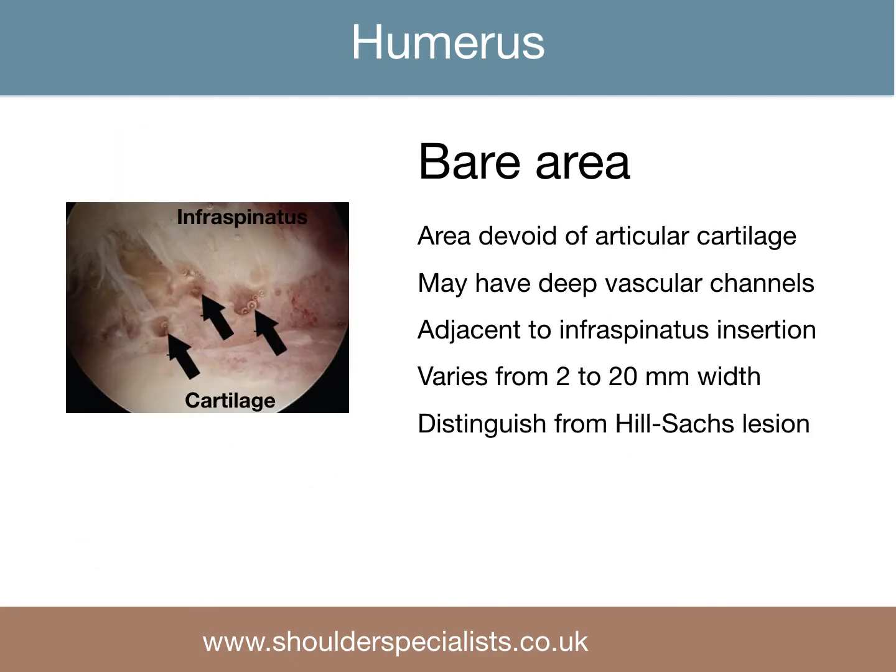There is also a bare area on the humerus which is devoid of cartilage, of variable width, adjacent to the infraspinatus insertion. This may contain deep vascular channels, and should not be confused with a Hill-Sachs lesion, which will have normal cartilage medial to it.